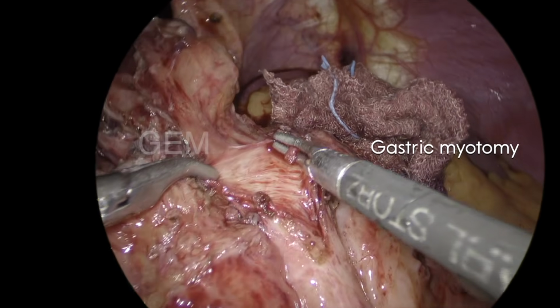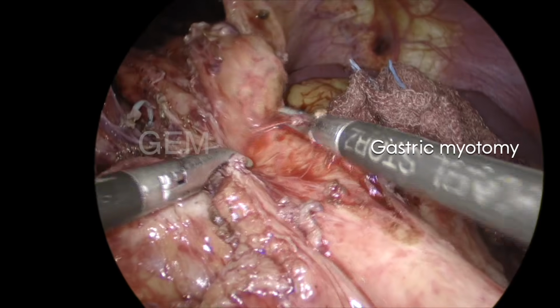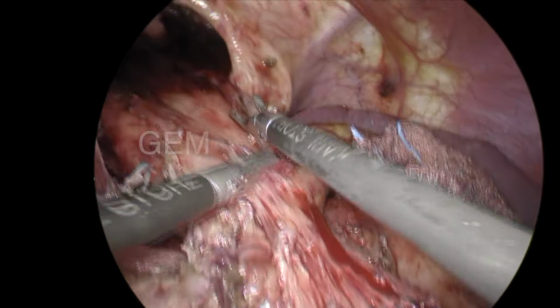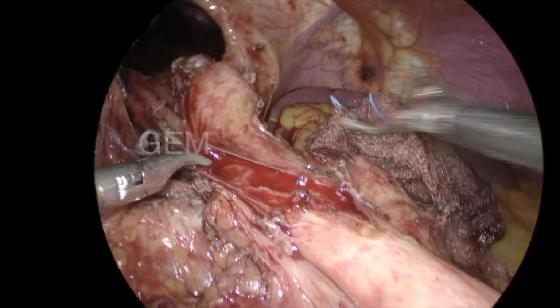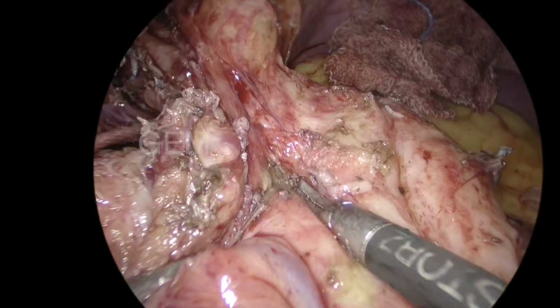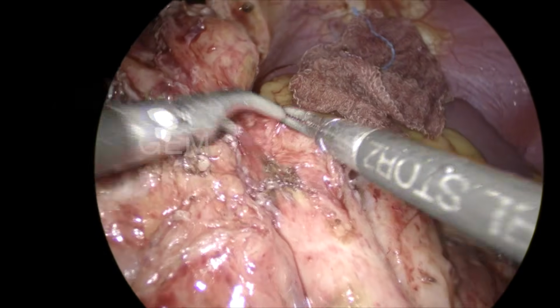You can see I started the myotomy from the stomach side, the gastric side. I am not starting from the esophagus because the esophagus is already done, and we don't know up to what level we have to go. So if you start from below and go up, and all the myotomy is divided, the mucosa meets mucosa, that means I'll stop the division. So that is the idea. I'm not starting from above, I'm starting from below upwards.